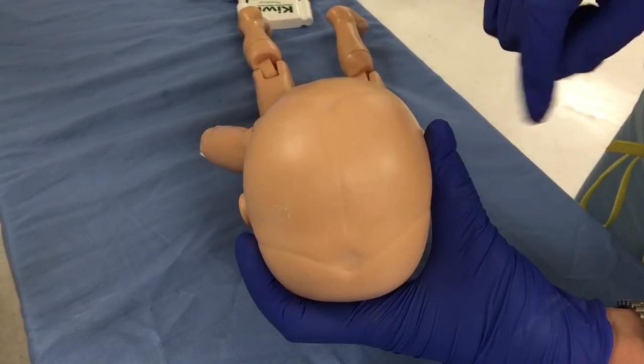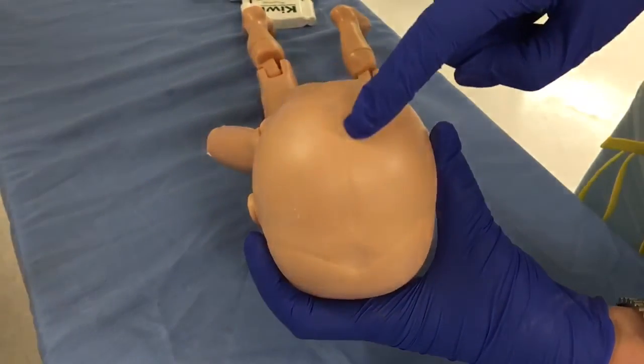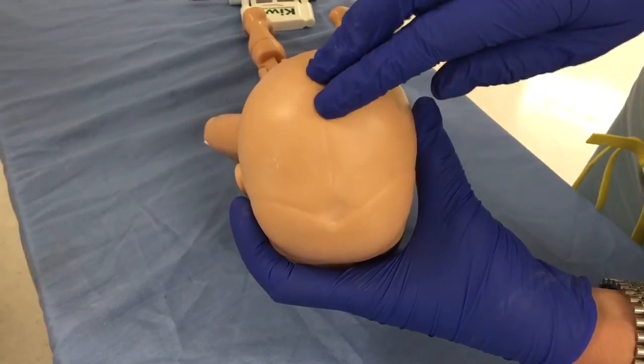Now let's discuss actual placement of the vacuum. The vacuum will be placed on the fetal scalp. You want to ensure you are placing the vacuum on the flexion point. The flexion point is located on the sagittal suture, 3 centimeters in front of the posterior fontanelle, and 6 centimeters from the anterior fontanelle.